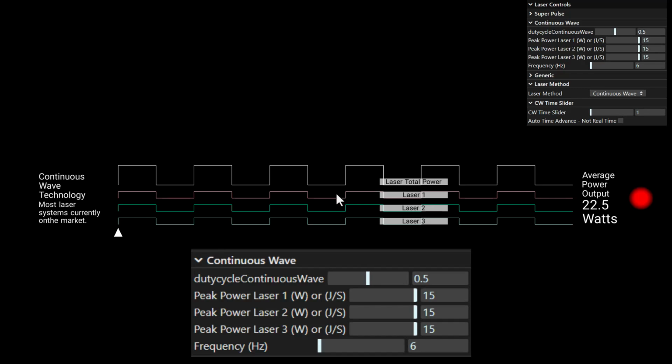These lasers are often different wavelengths as well. So laser 1 in my example could be 635 nanometers. That would be red. Laser 2 could be an infrared frequency, and laser 3 could be another infrared frequency. So this is oftentimes 1064 nanometers. And these are just kind of numbers you just have to remember. There's only a few of them that are used in the lasers anyway. So once you kind of heard them a few times, you go, oh yeah, okay, that's familiar. I'm familiar with that.